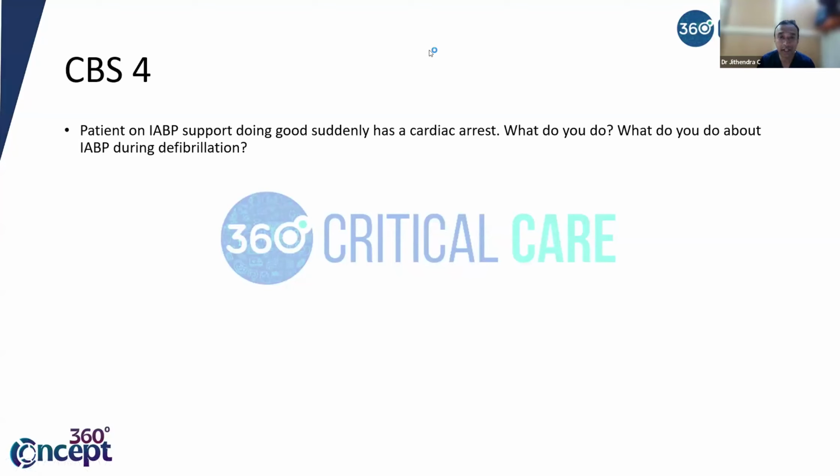So somebody said, yes, correct. Put onto auto mode. You can change to a pressure trigger. Very good. Auto mode is the safest answer. So what about defibrillation? I think for the first question, most of you have answered it correctly. Put onto auto mode, a pressure trigger is absolutely right.